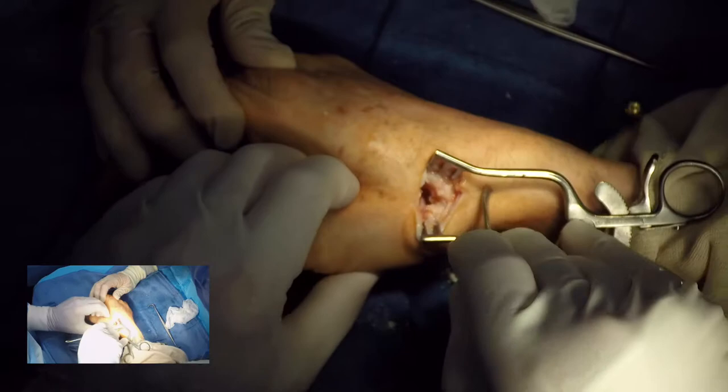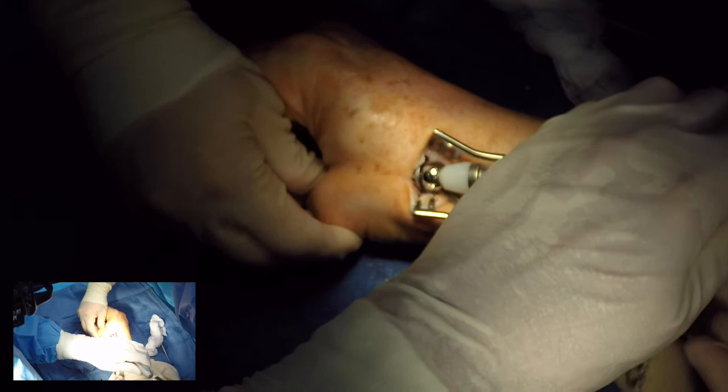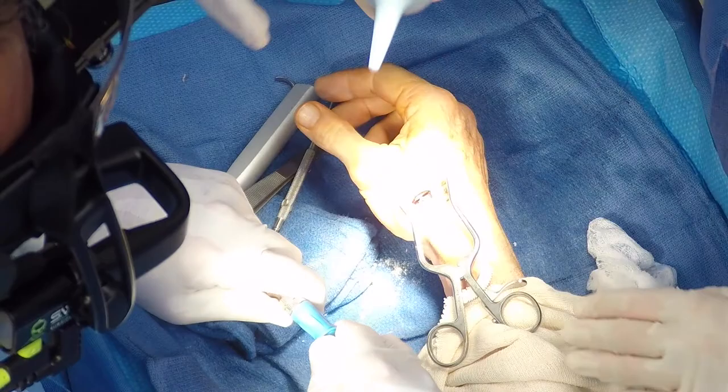The definitive implant has a plasma spray titanium for bony ingrowth and will require mallet impaction for good fixation. Reduction is then easily done with abduction of the thumb, noting that there is again good stability. The joint will be irrigated out.